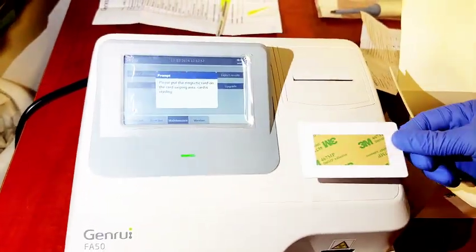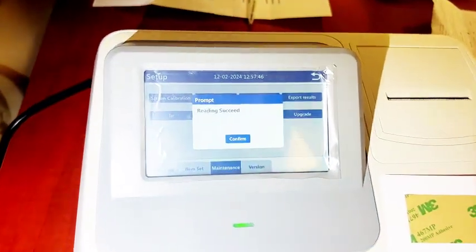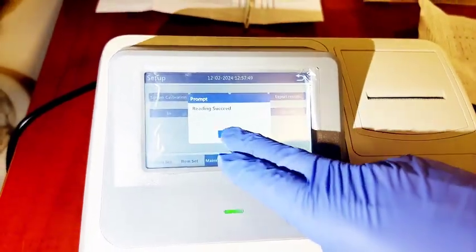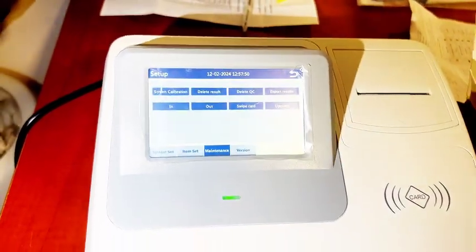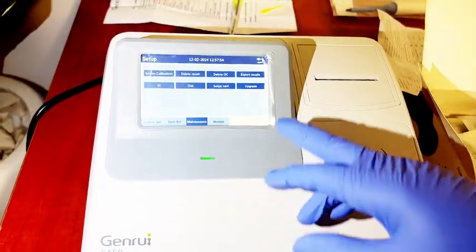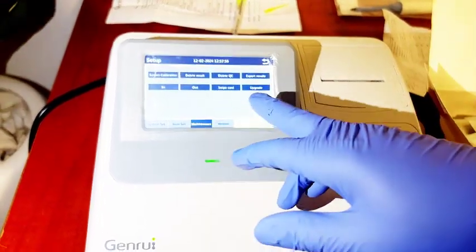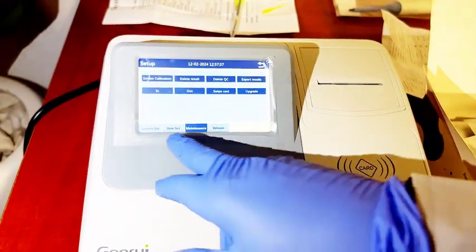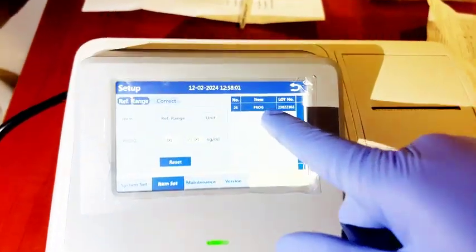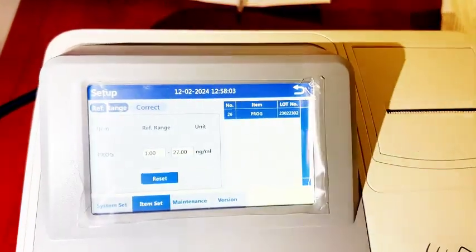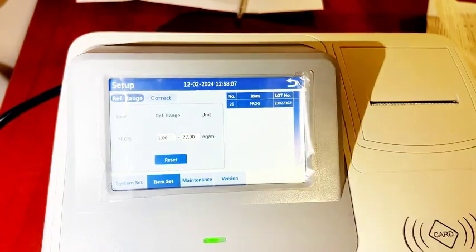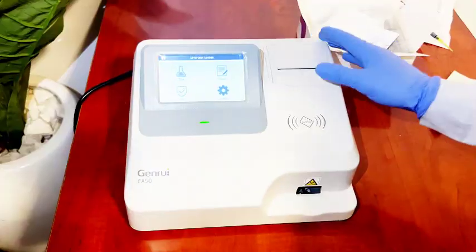You read your card. Add reagent, then confirm. Progesterone has been captured. If you want to check, go to Item Set and you will see your Progesterone has appeared in the machine with the reference range set automatically.